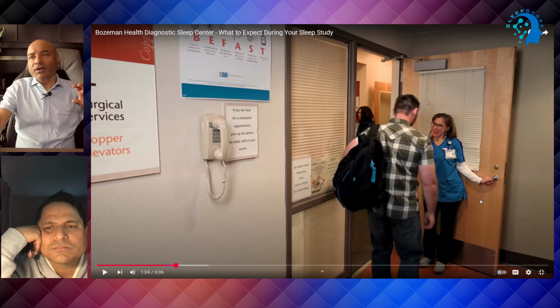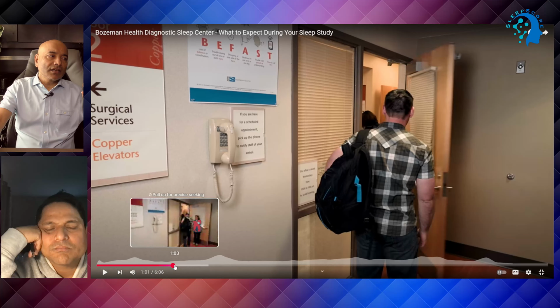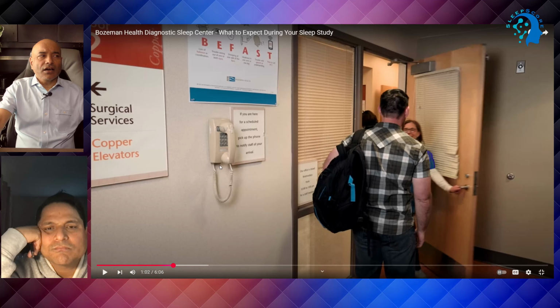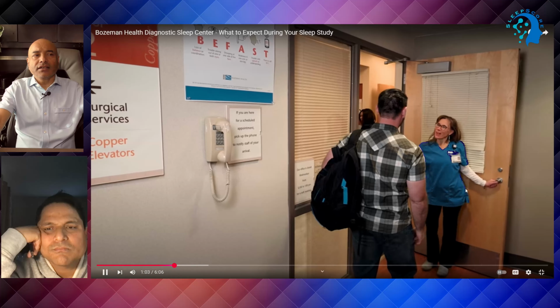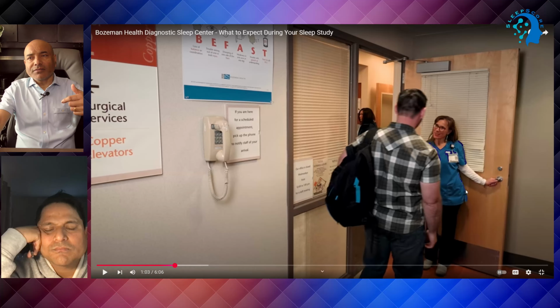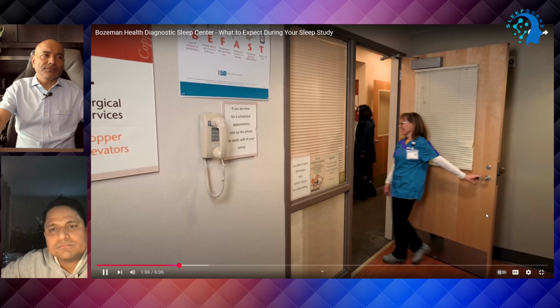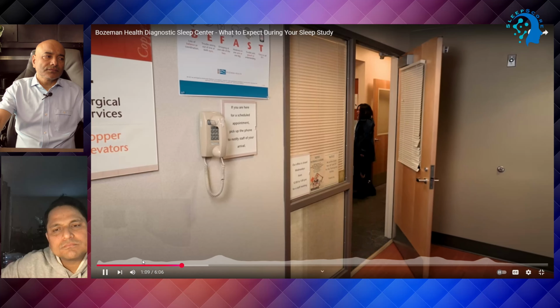So normally when they come to the sleep lab, they ring the bell. In the hospital, they pick up the phone. The technologists come out and they welcome the patient and take him to your room. It is our goal to make you as comfortable as possible during your sleep study.